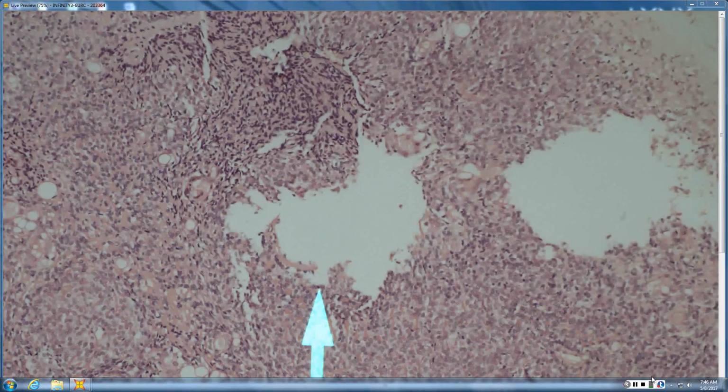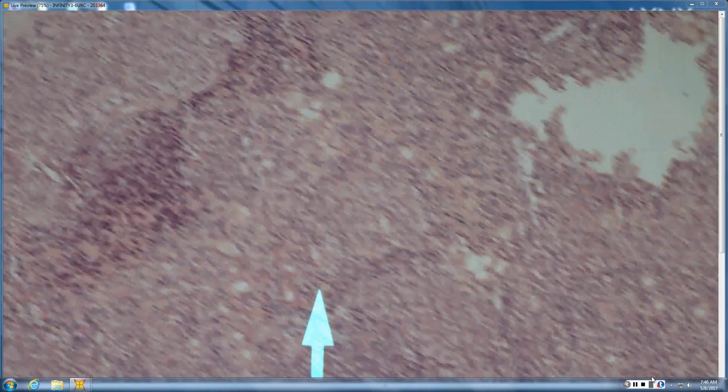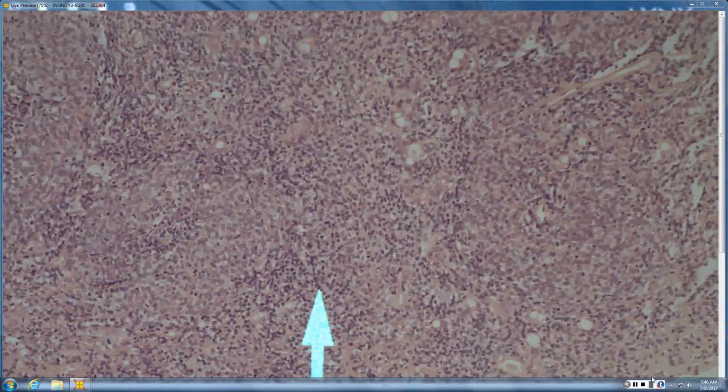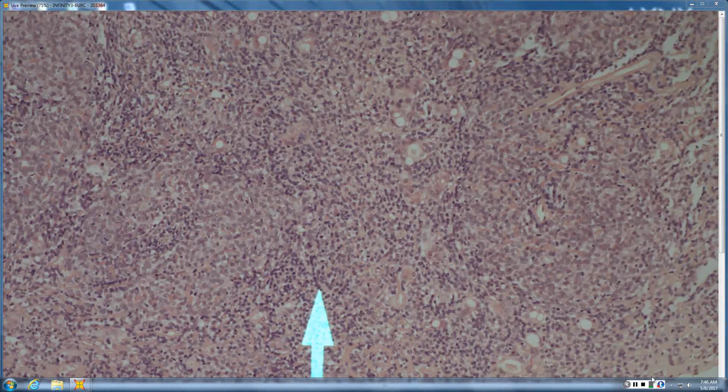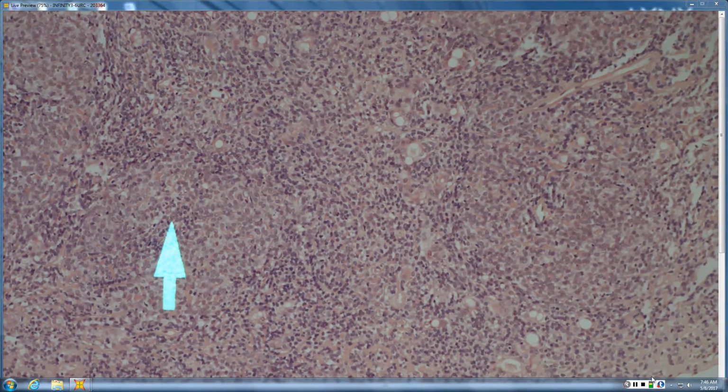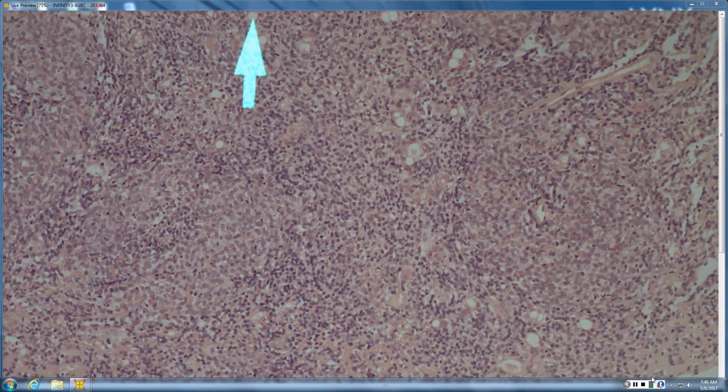Looks like we have a nodule. There's a mix of larger blue cells and then grayer cells. Yeah, so it's paler blue cells and grayer blue cells, and it's speckled with jet black lymphocytes, and it has duct differentiation, and you correctly said it is a spiroadenoma.